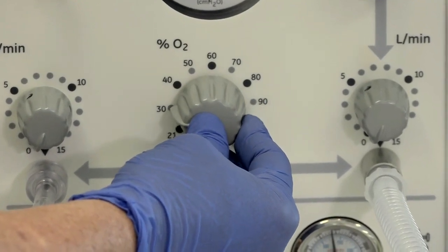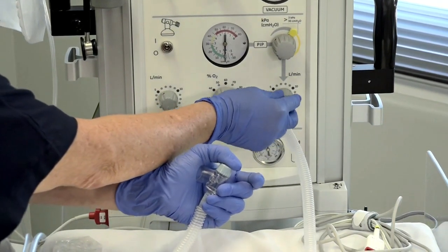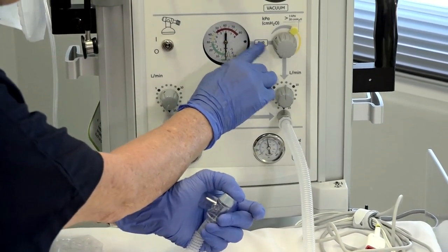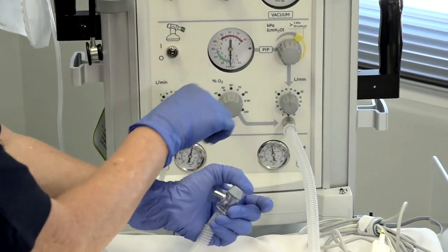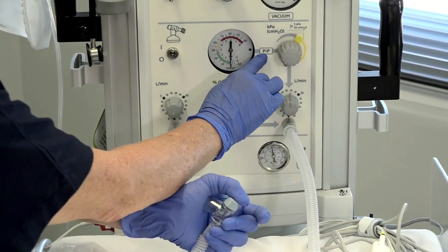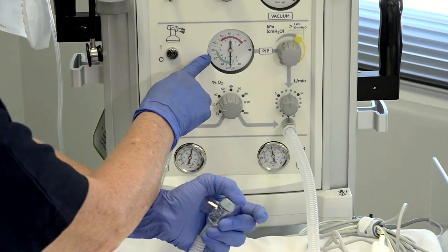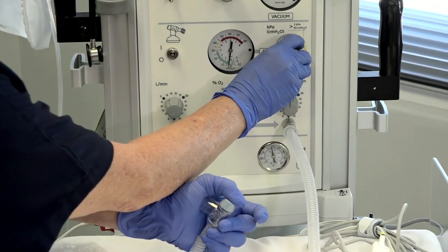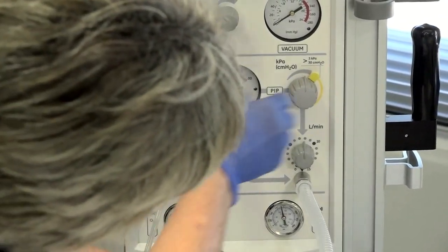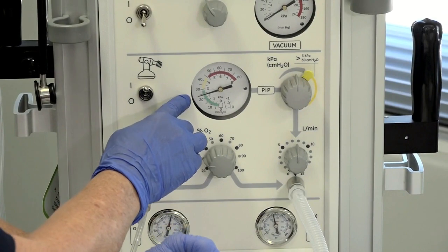Our oxygen setting will be 30% in keeping with the WA Addendum. We need to increase the flow from zero up to 8 litres. Look at the manometer and the flow — we've got a flow of 8 litres but nothing's moved yet. We now use the PIP dial, the inspiratory dial, and turn it clockwise to achieve the pressures visible on the manometer. Turning it up slowly, we've got 25 centimetres of water for a baby who is 33 completed weeks or less.